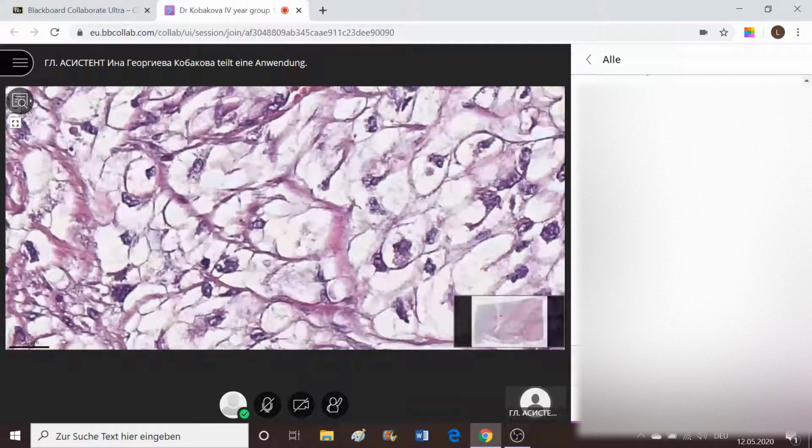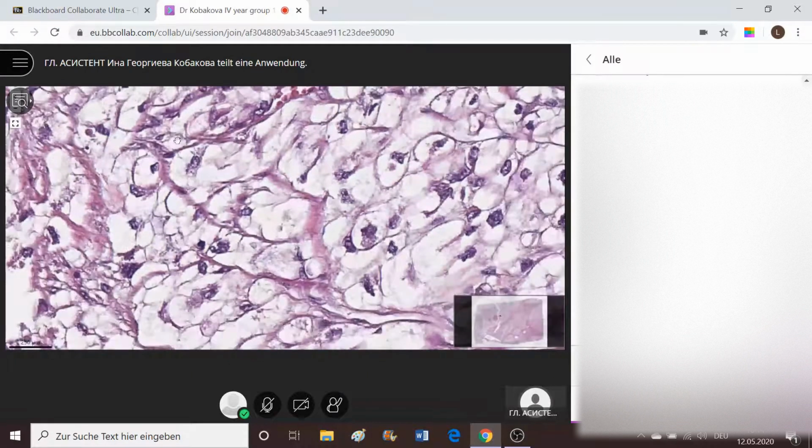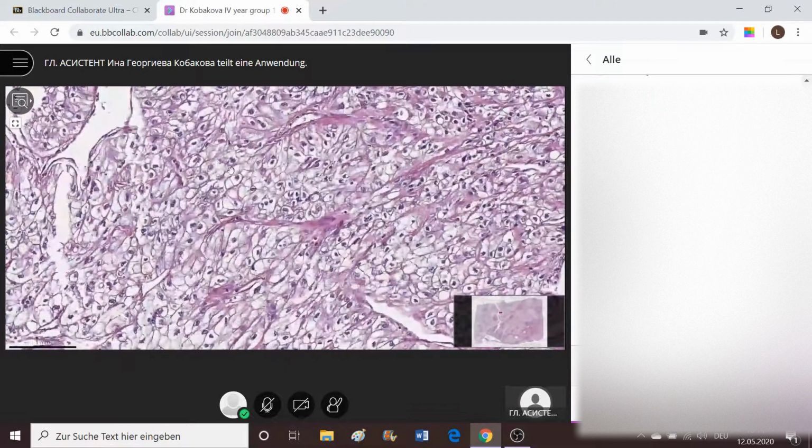Depending on the magnification on which we observe nucleoli, we stage this tumor through different Fuhrman grades and stages. But I think that one of you had a presentation about Fuhrman staging and grading, the Fuhrman scale, which I think is not quite necessary for your exam. Yet you should mention that by the presence of these nucleoli and by the magnification, you might be able to put this type of tumor through different grading appearances.